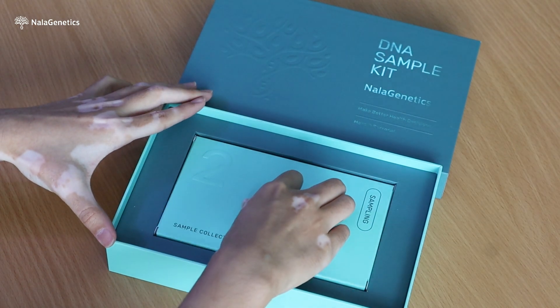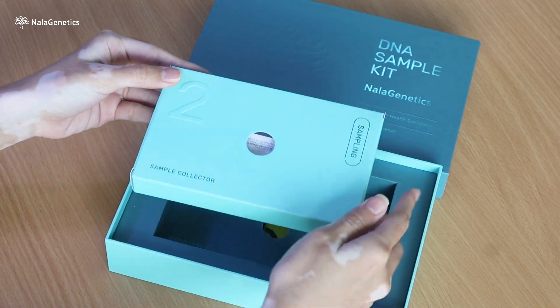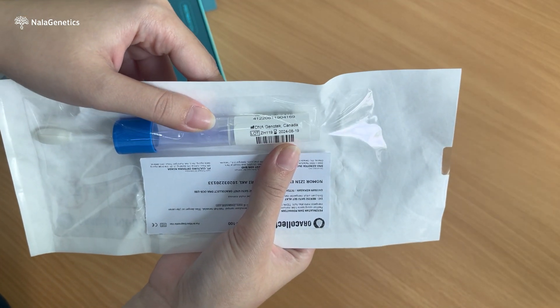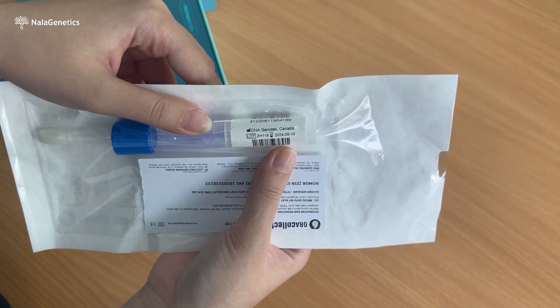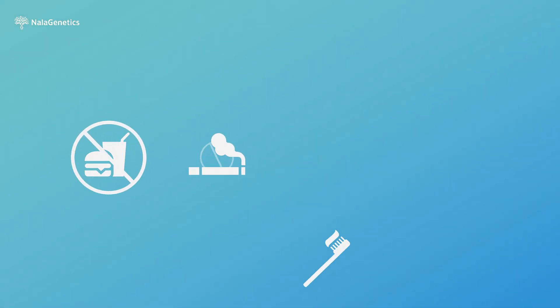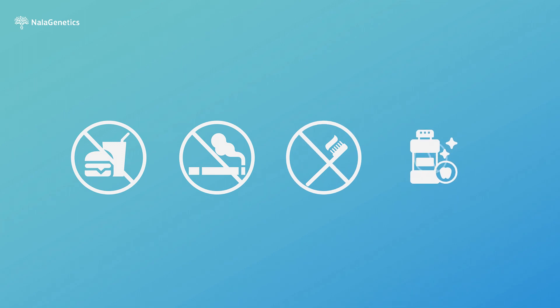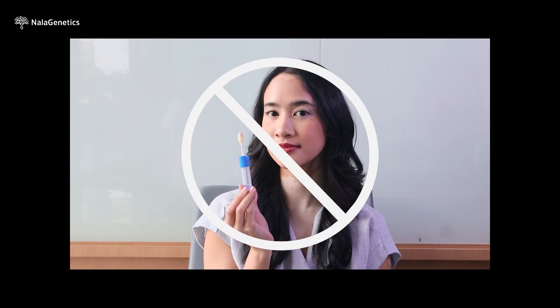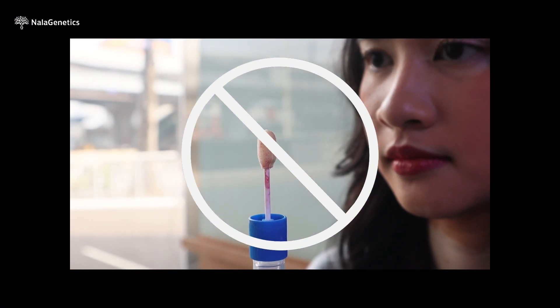Second, please make sure that you have received the buccal swab to take your sample. Check the expiry date of the buccal swab and let our team know if you received an expired one. Please mind to not eat, drink, smoke, vape, brush teeth, or wash your mouth at least 30 minutes before taking the sample. Please refrain from using lipstick to avoid staining the buccal swab.